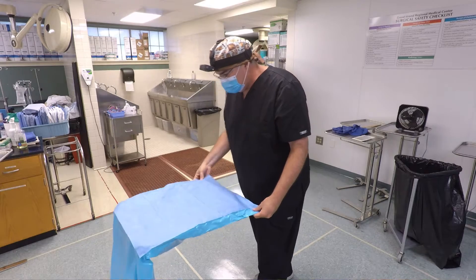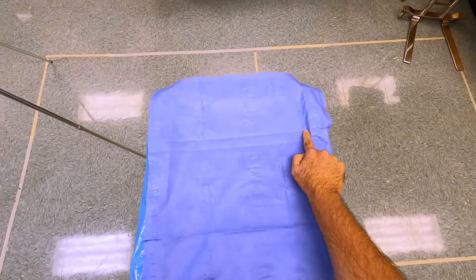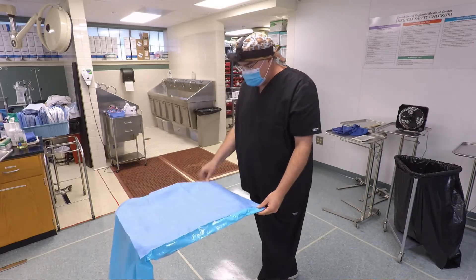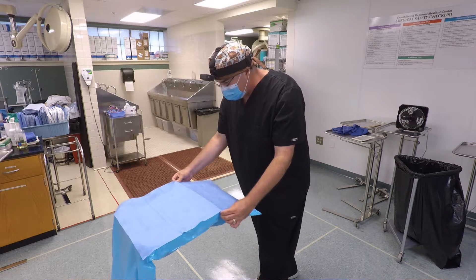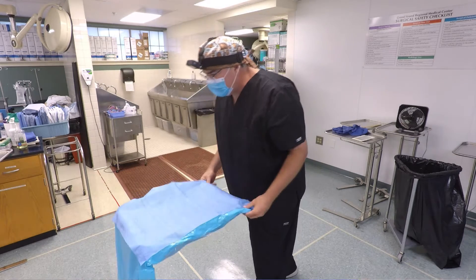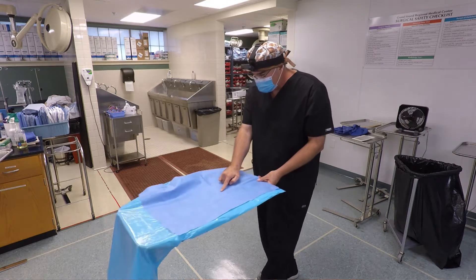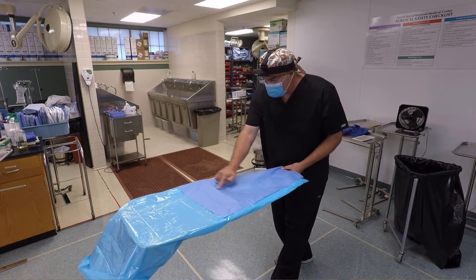I'm going to find the creases. See the crease here — there's another crease here from when it was originally packaged in the factory. These are my friends; these are going to tell me how I want to fold it. This one's telling me I want to go under, this one's telling me I want to come up. So the first fold I'm going to make is go past the first one and bring the second crease to the edge of the Mayo stand.